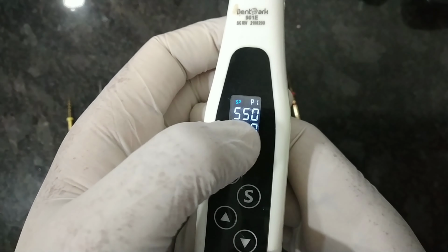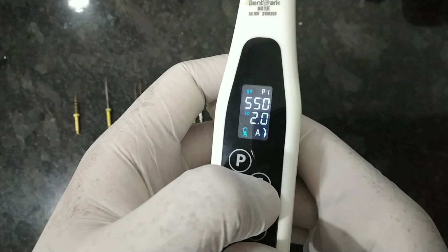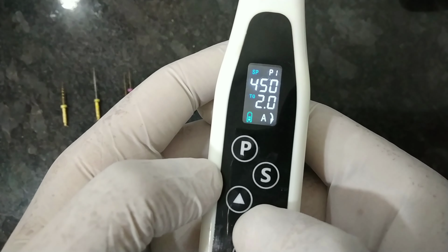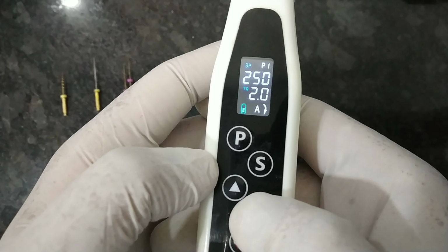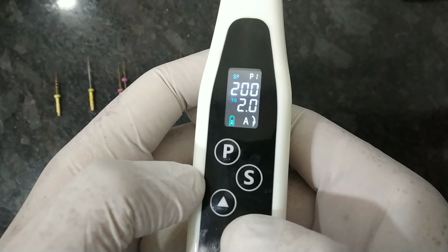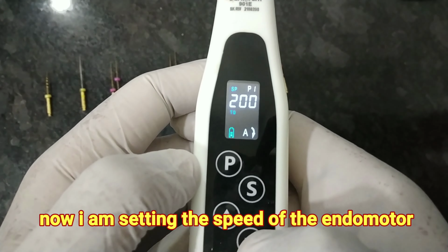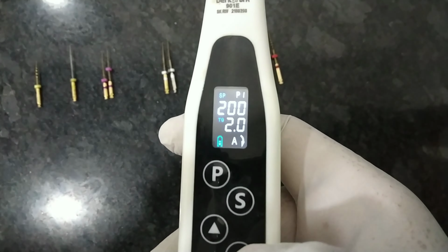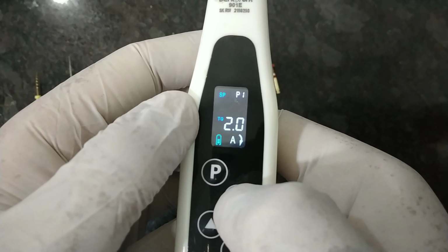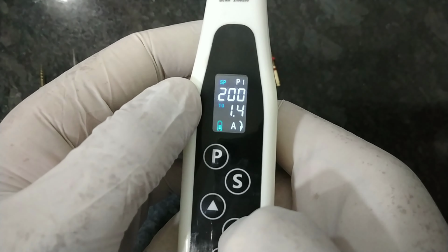So suppose we want to change the RPM. What we have to do is press this button set, and then you can increase it or decrease it. So we have set the revolutions to 200. Now you want to change the torque. Suppose the torque is 2 and you want to reduce the torque on the endomotor. Then you can reduce it by pressing this button. So now see, I am reducing the torque.